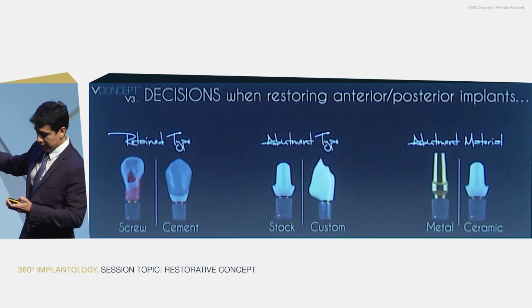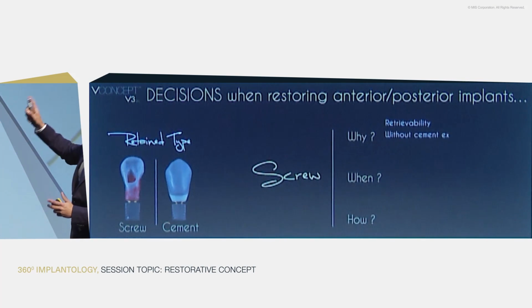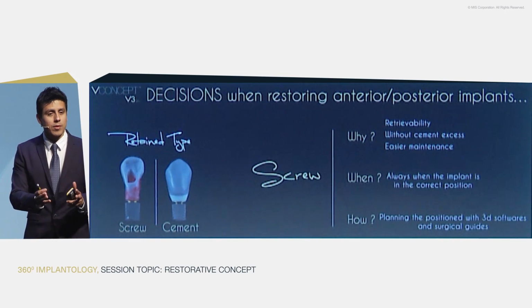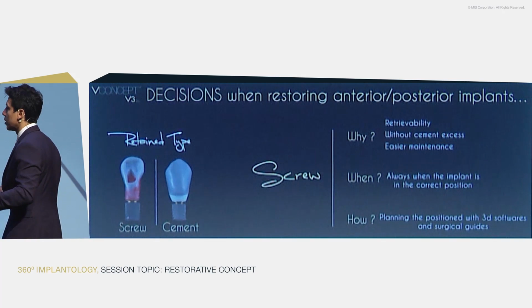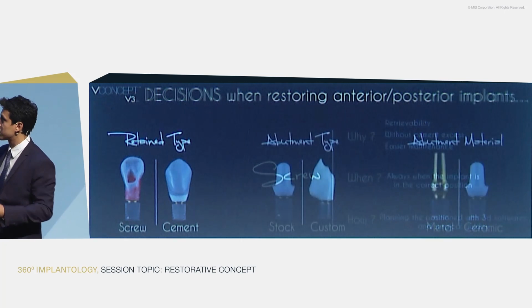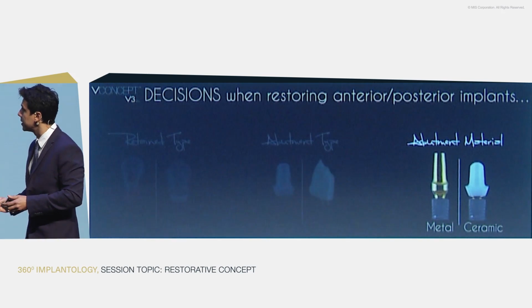Without cement, easier maintenance, always when we have the implant in the correct position. And to work with this, we know that if we work with 3D software and surgical guides, we will achieve this outcome. Now let's talk about the abutment material a little bit.